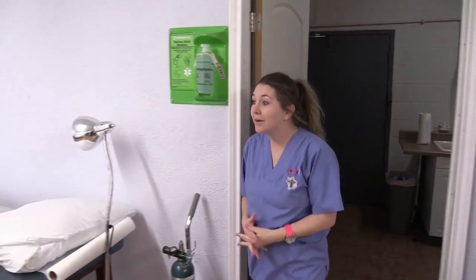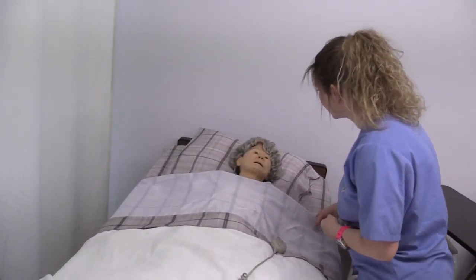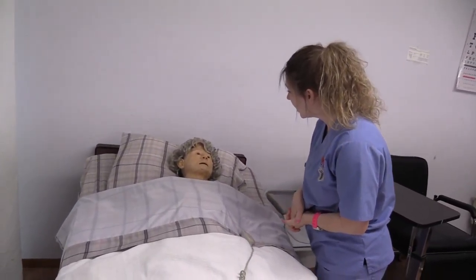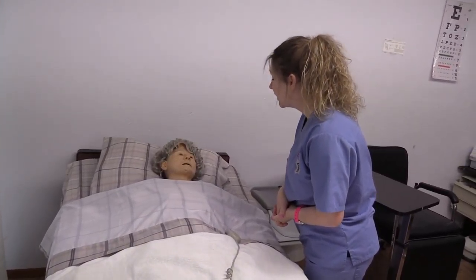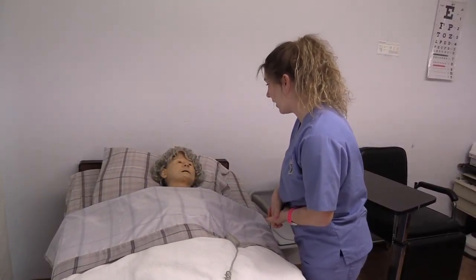Come in. Hi, Miss Jane. My name is Tiffany. I'm going to be your CNA today. We're going to do catheter care on you. Is that okay if we go ahead and do that? Okay, perfect. I'm going to go wash my hands, gather my supplies, and then I'll be right back.